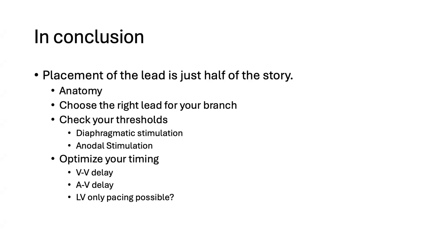What do you think about trigger pacing? Because you had talked about pacing percentage, and I've heard a lot of different answers on this. Do you think trigger pacing is viable, or do you think it just kind of makes us feel better because we see a higher pacing percentage?